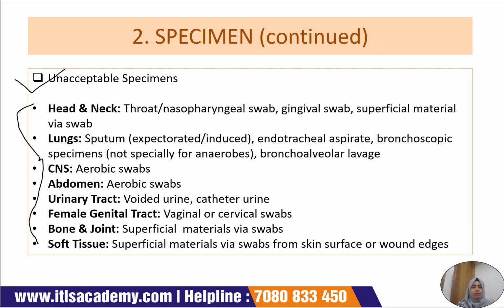From the central nervous system, aerobic swabs are generally not considered.